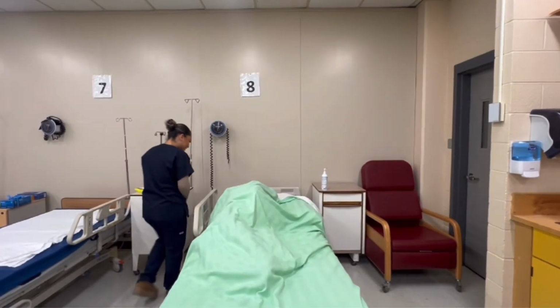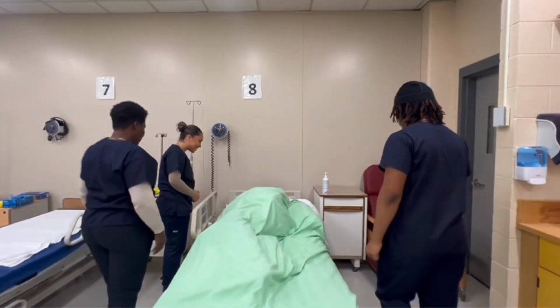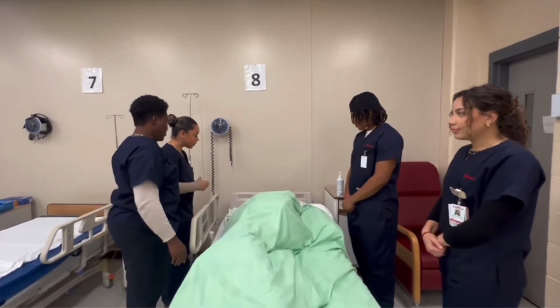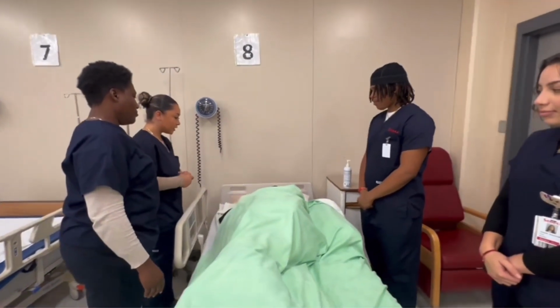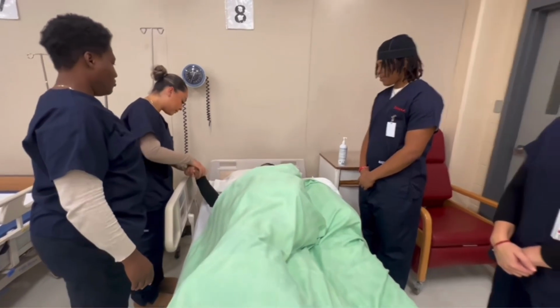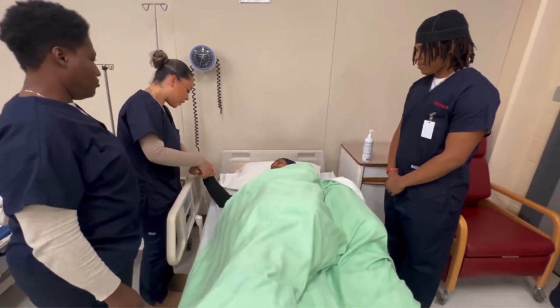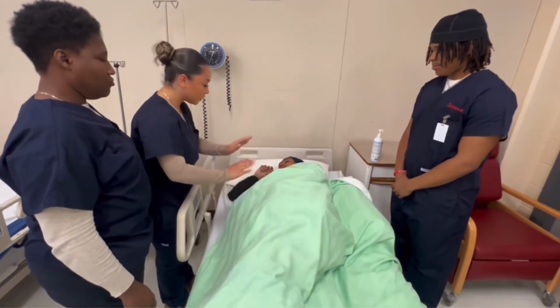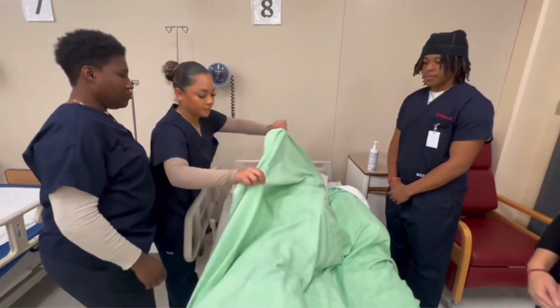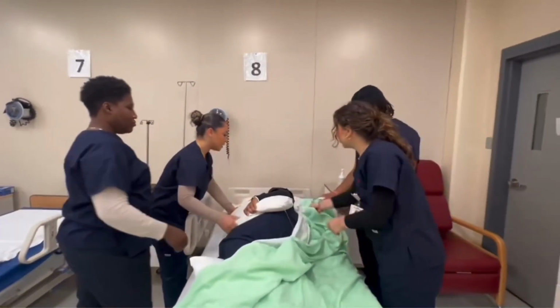Positioning the client from lateral to supine back to lateral. The nursing team is now entering the room to help the patient. The nurse is now checking with the patient how she's feeling and asking her what needs to be done. And the nurse is now checking her identity to ensure that she's matching her name and her date of birth. The nurse is now telling the client that we are going to move them accordingly to help with the pain.